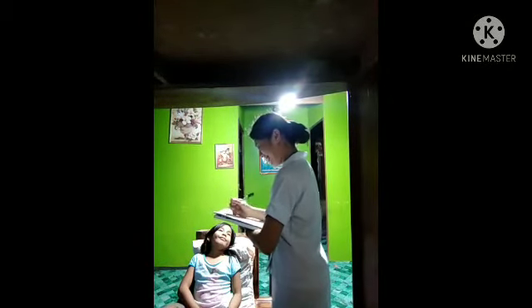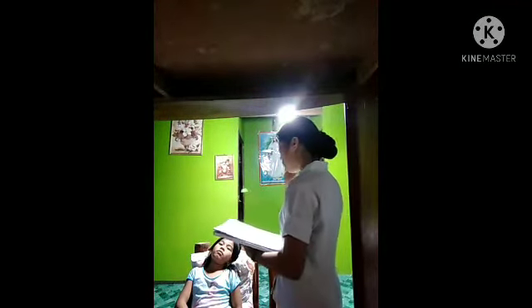Identify the patient by checking the name and identification on the patient's identification band or ask the patient to state his or her name. This is because identifying the patient ensures the right patient receives the medication and helps prevent errors. Explain procedure to the patient. This is to gain cooperation and allay anxiety.